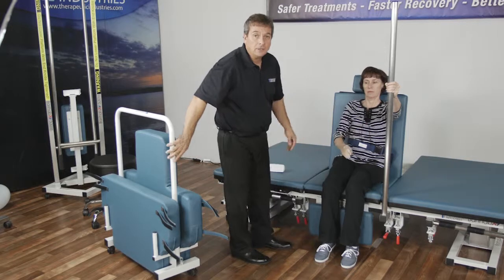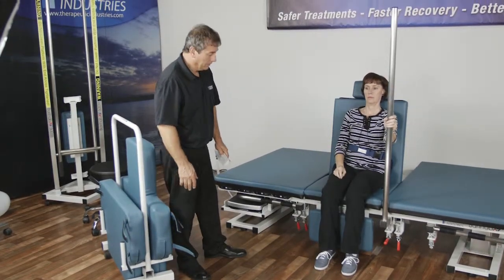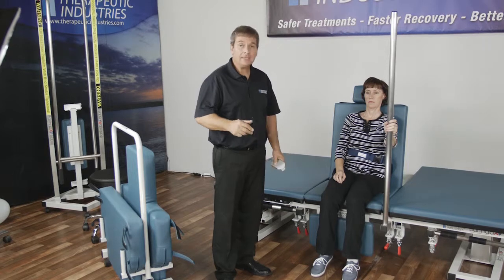Another way is that you can raise the Berry Hab so you can imitate whatever height their bed is or the seat that they need to get up from.